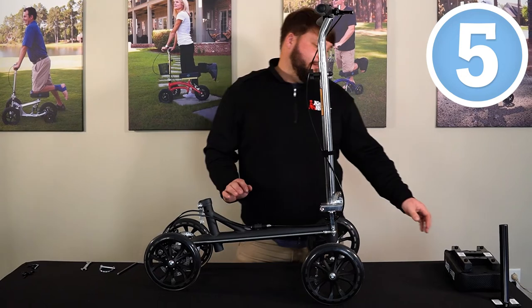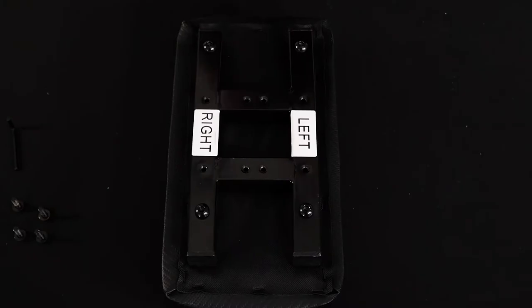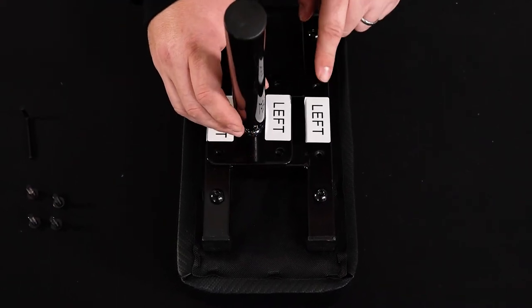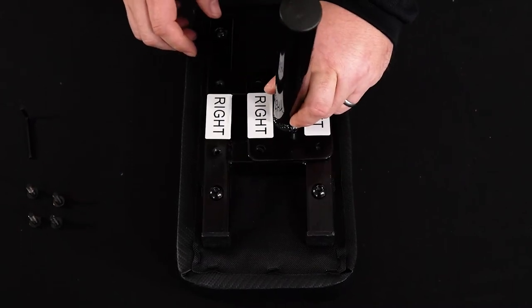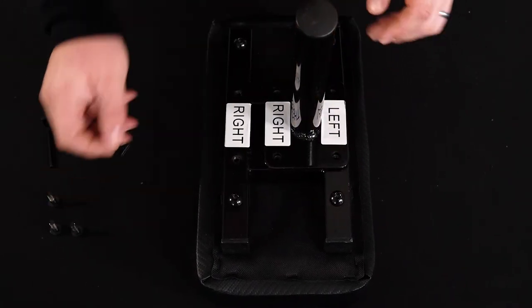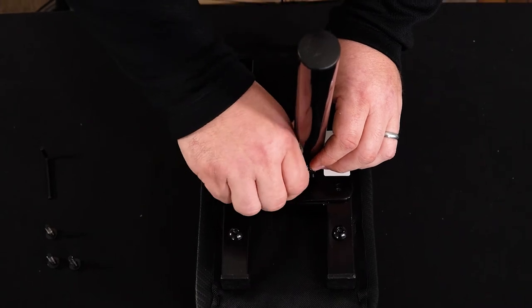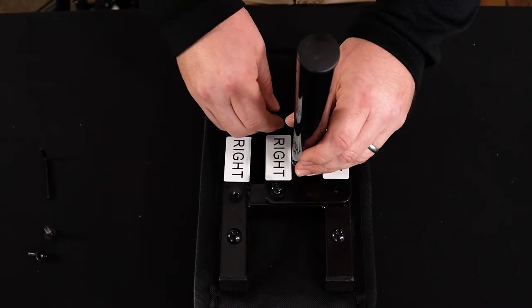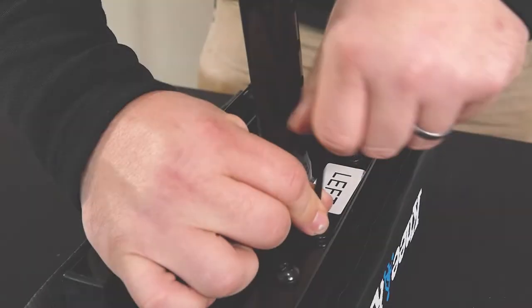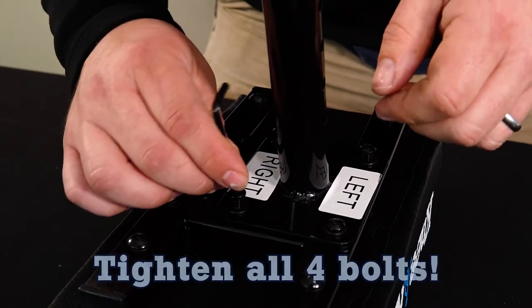Step number five is going to be assembling your knee pad. If you have a left leg injury, you're going to line it up like this — left, left. If you have a right leg injury, you'll line it up just like this. For this video, I'm going to go ahead and do right, right. Take your bolt — already went ahead and pre-assembled them with the washers — and you're just going to line it up here. Screw them all in hand tight and we'll go through and finish them off with the allen wrench. Tighten that up and continue along with the rest of them.